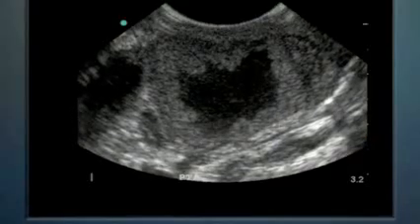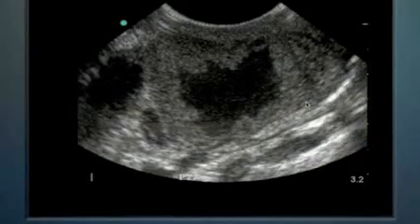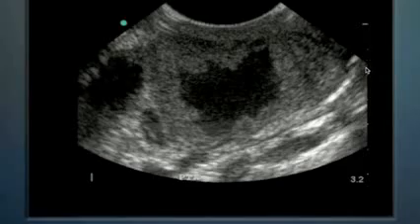This is a very large peritonsillar abscess. We see over here that these are 0.5 centimeter hash marks, so 0.5, 1, 1.5, 2, 2.5, 3, a little bit more gives us 3.2 for the depth. And this is measuring about a 1.5, almost a 2 centimeter diameter in its longest axis peritonsillar abscess. You think about that, it's a very large one here, very prominent, and this is the intracavitary transducer we have in the mouth, and we can see this very prominent peritonsillar abscess here.